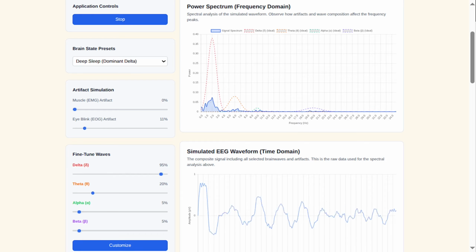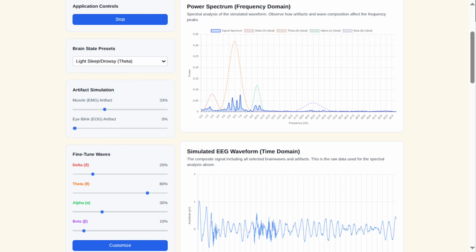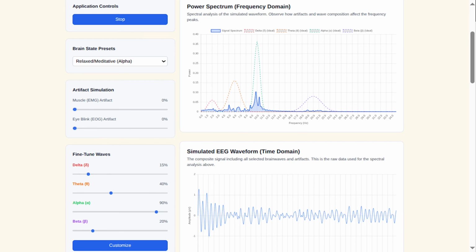Okay, so we have fully penetrating deep brain recordings, intracranial. Then we have ECOG, electrocorticography, so that's on the surface of the brain. And then we have surface, which is outside the brain, but do we have anything else?